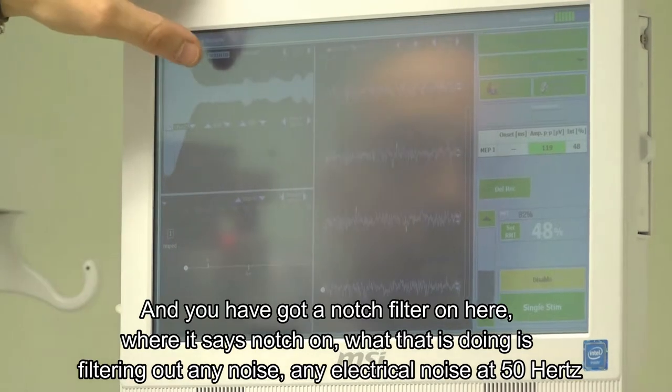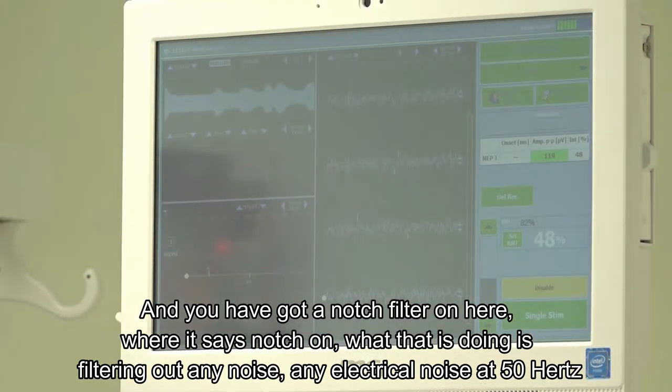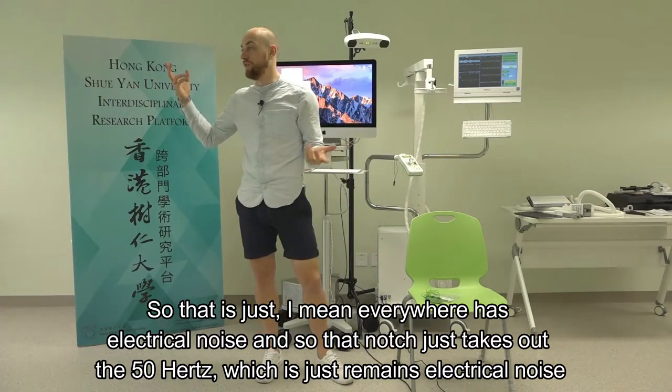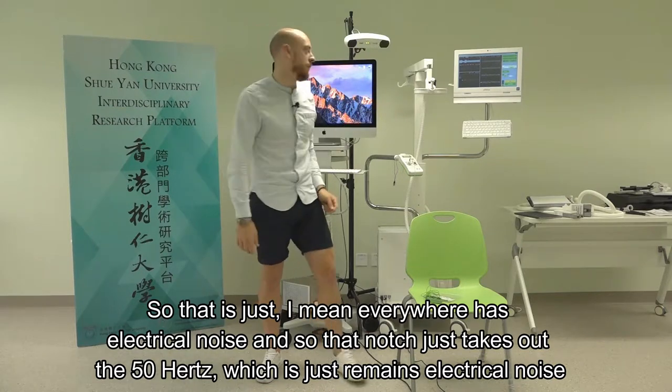There's a notch filter on the device - 'notch on' means it's filtering out any electrical noise at 50 Hz. Everywhere has electrical noise, so the notch just removes the 50 Hz mains electrical noise.